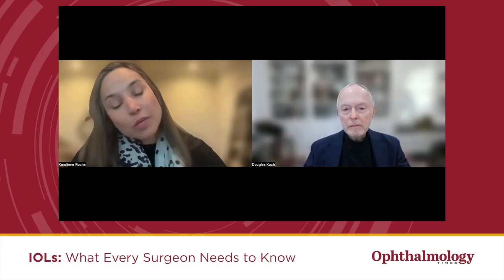I always like to under promise, over deliver, right? Because we know with binocular summation, with both eyes, patients actually see one line better. It's important to report monocular depth of focus curves. But when we're measuring binocular, we know patients see one line better, and they will be surprised. Some patients can sometimes even read smaller print without glasses with this technology. But again, it's in the monofocal category. You don't want to promise glasses free, but you'll be surprised sometimes.